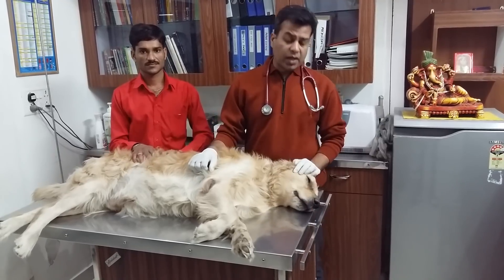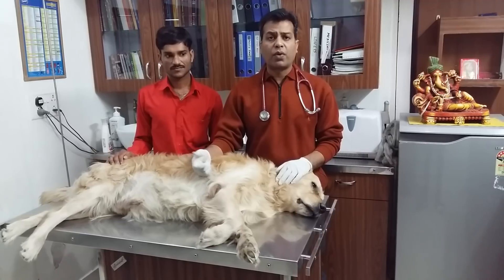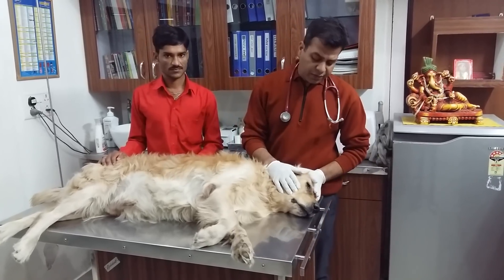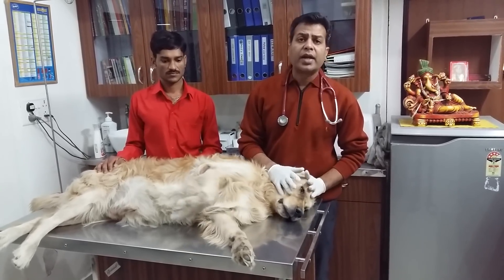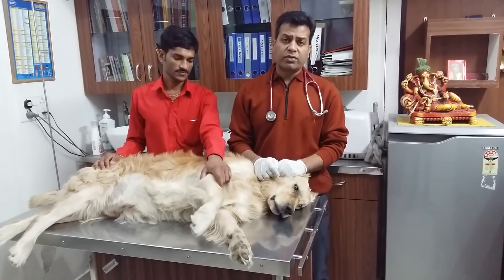For flushing the nasolacrimal duct, we can use a small 22-24 gauge cannula. On the medial side of the eye, on the lower and upper eyelid, there is a small opening through which we can pass the cannula.